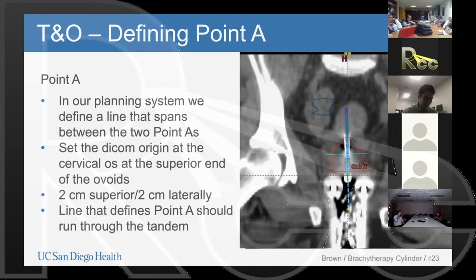And as you said, the impact of even half a millimeter at the close distances that we treat has an impact dosimetrically speaking. So good point that at the time of your commissioning efforts, it's important to realize that lots of folks use plastic applicators, and perhaps the extent of those might be somewhat better visible in a CT image than a titanium tandem. So it's a good thing to pay attention to. Yeah, definitely something that we need to be concerned about. Thanks for that, Michael.